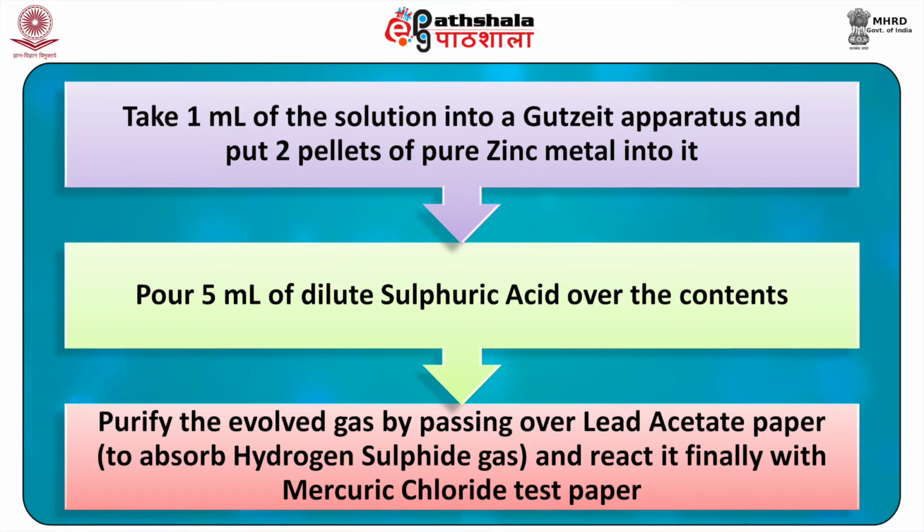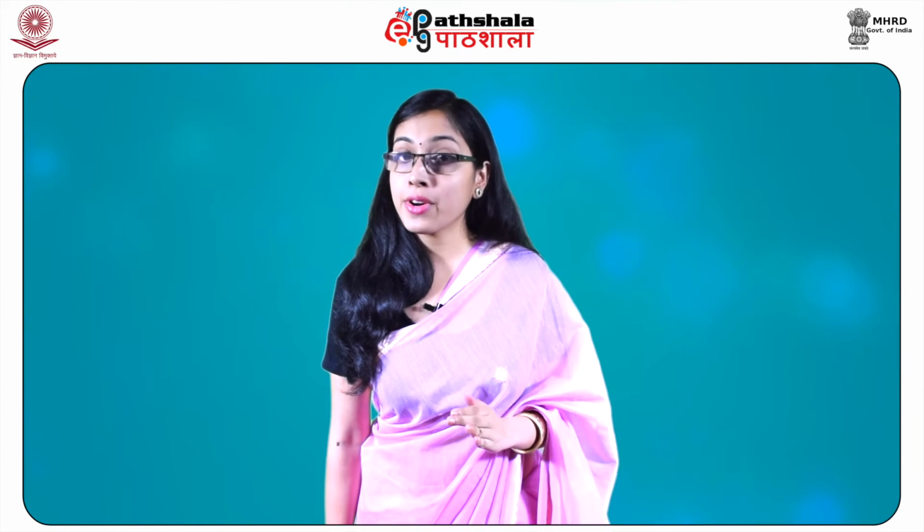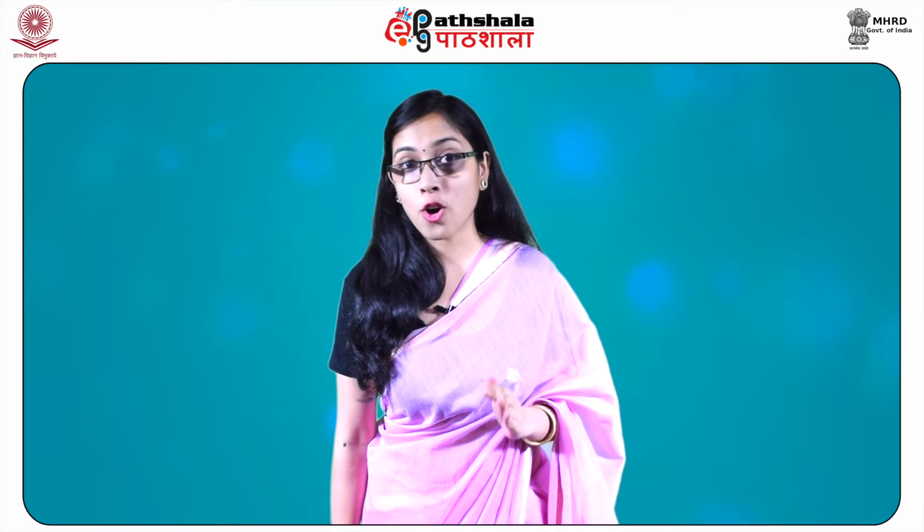The evolved gas is purified by passing over lead acetate paper so as to absorb the hydrogen sulfide gas, and is reacted finally with mercuric chloride test paper. A yellow stain on the paper indicates the presence of arsenic.